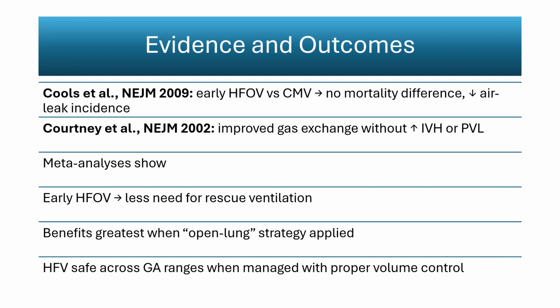The key determinant of success remains avoidance of large pressure swings, maintenance of adequate lung volume, and precise control of oxygen exposure. The collective evidence therefore supports high-frequency ventilation as an effective tool within a comprehensive lung protection framework. Its advantages are realized when it is introduced before severe injury, managed with attention to physiologic feedback, and integrated with strategies that stabilize hemodynamics and minimize oxidative stress.